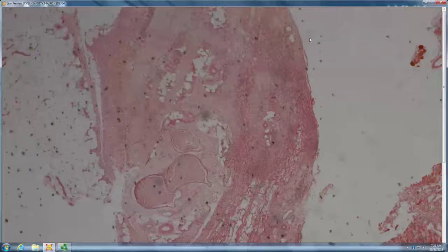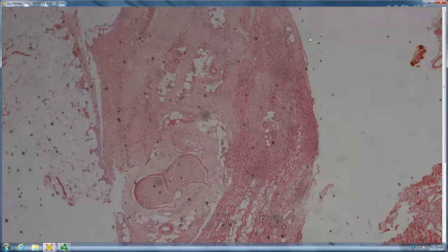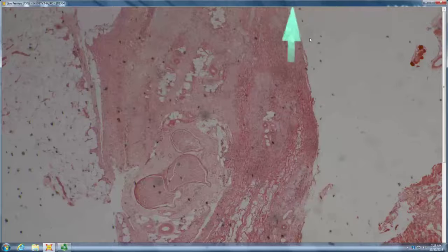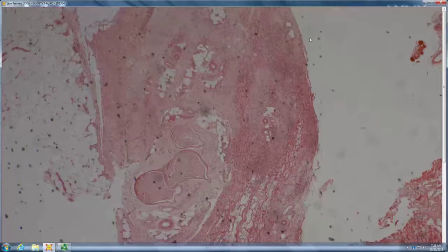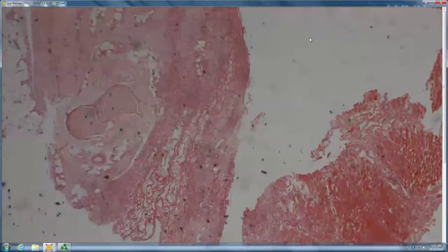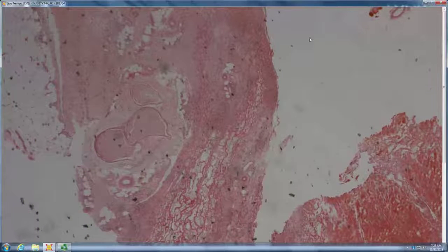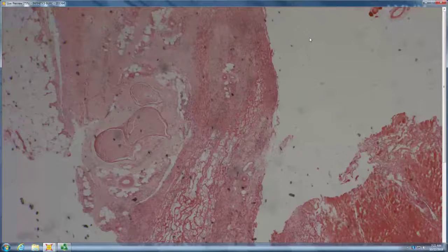Yeah, so I was thinking about eosinophilic fasciitis. So it's certainly the location and configuration of eosinophilic fasciitis. Where are the eosinophils? You may not have them even. It's named for peripheral eosinophilia, so it's named for the blood, right? So where's the eosinophilia? Number one in the name, number two in the blood. Sometimes you don't see them reliably in the tissue. They may be there, but it's plus minus in the tissue. What makes the diagnosis is just the location and organization of the lesion. So it tends to be in the area of the fascia, which is immediately adjacent to the striated muscle, parallel to the surface, usually prominent fibrin deposition and a mix of inflammatory cells, very widened fascial structure.